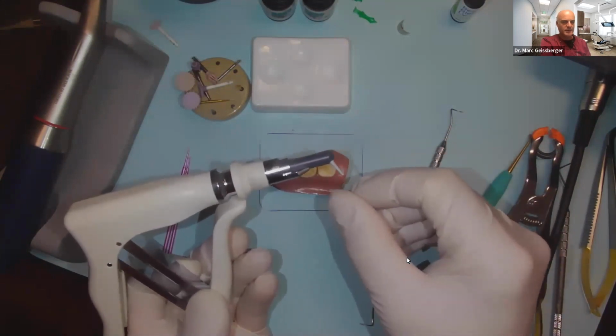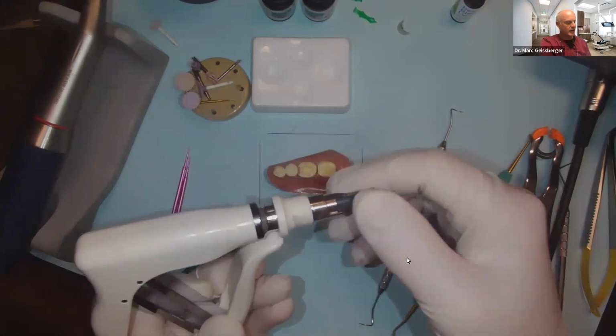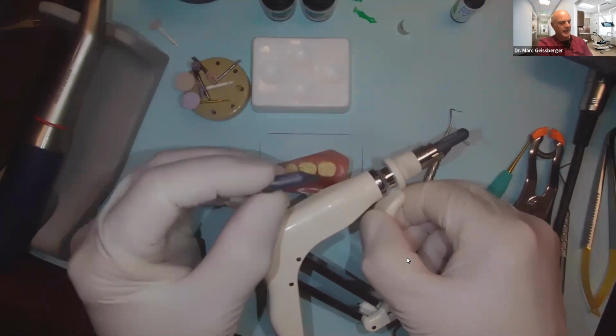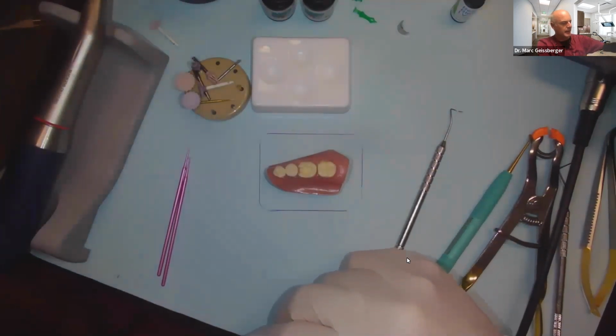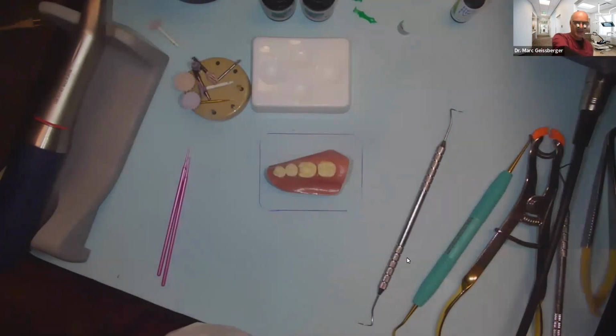So if I want it real steep, I'll do that. If I want it flatter, I can do that. So I've got the flowable warming. In addition to that, I've got my compules of Evanesce A1 warming in the composite warmer. So I'm going to place that back and do that. Now, the first thing I've got to do to make this a go is put on my loops, and I'm going to zoom back in and refocus. So bear with me for just a second.